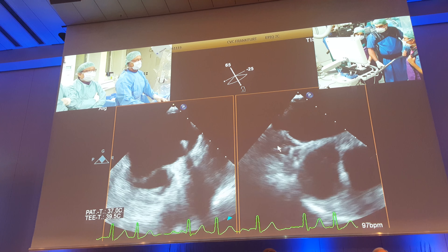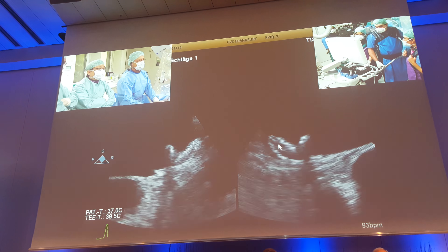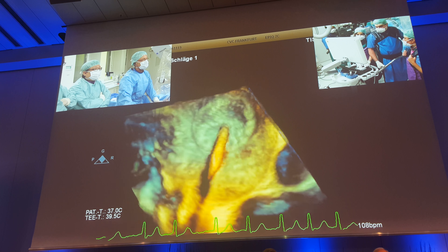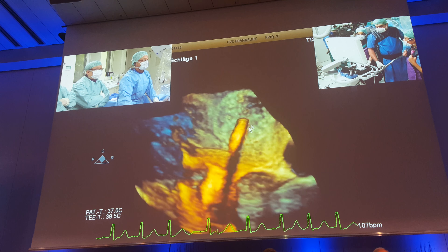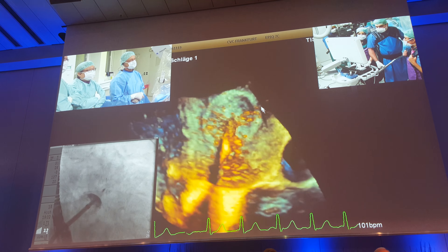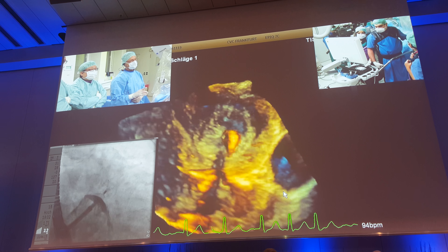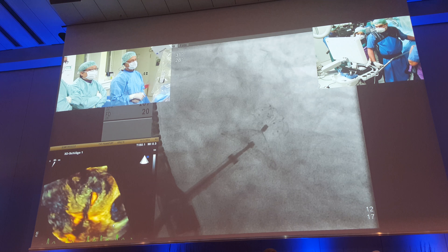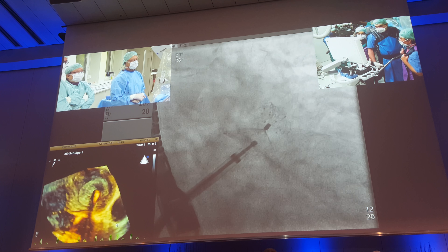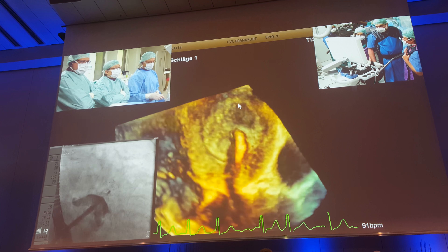You can see that concavity as well. If we're happy with that — there is a small gap. I don't think it's fully covering the appendage as it stands. I'm just going to show you in 3D as well. You can just see on 3D that there's a slight gap at the back there. Very small gap. It's much less than what I had from previously, but there's a tiny, tiny gap that you can just see around the back there.